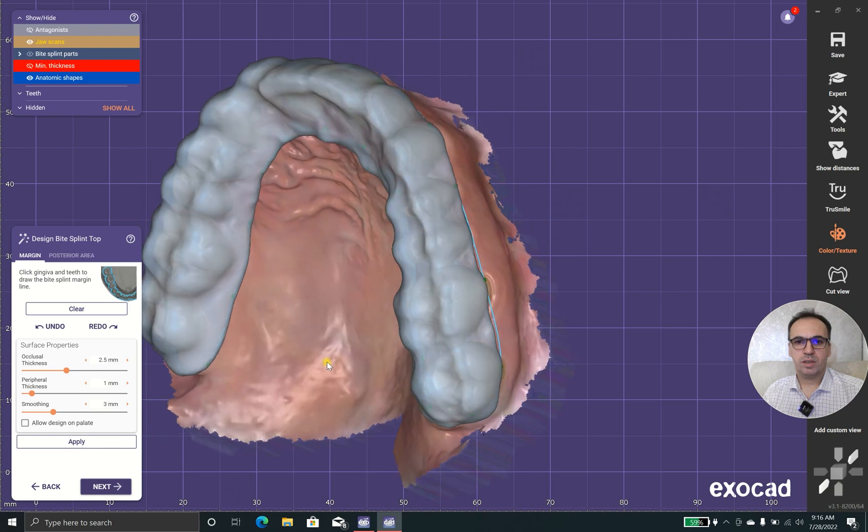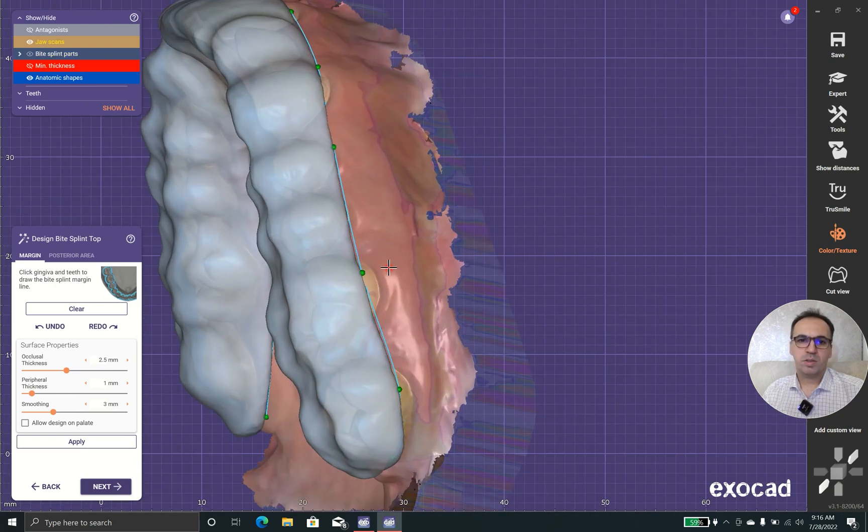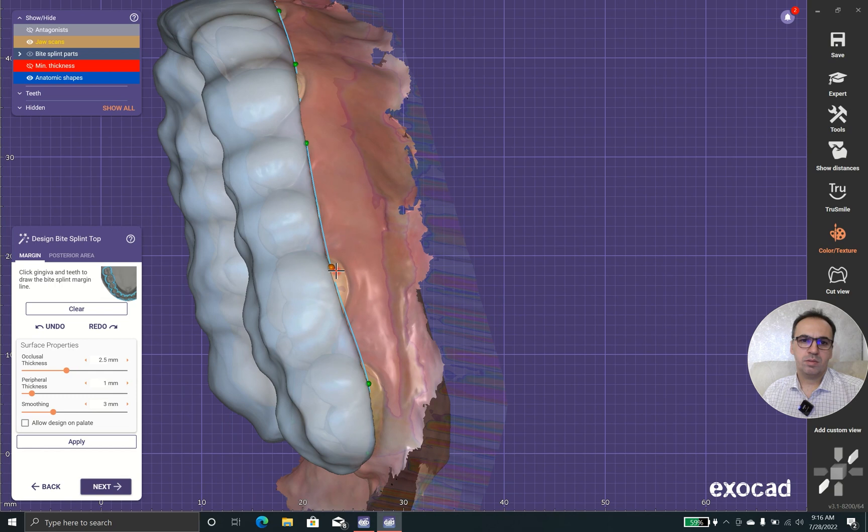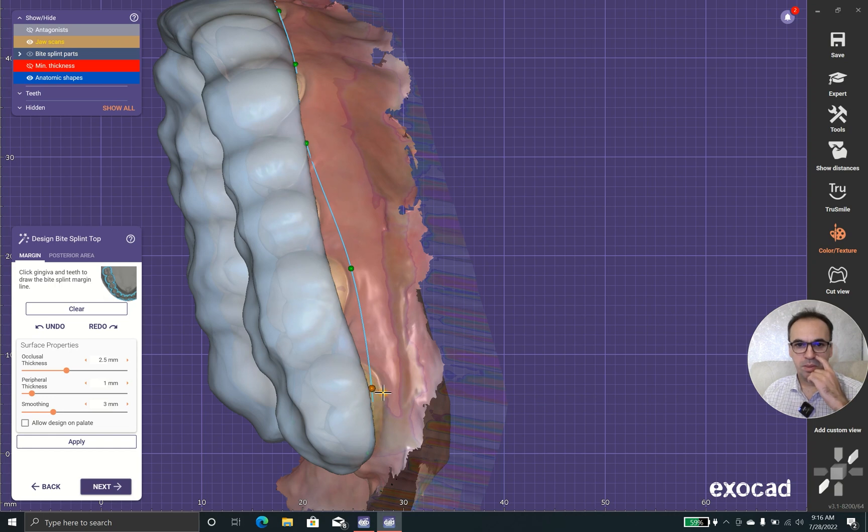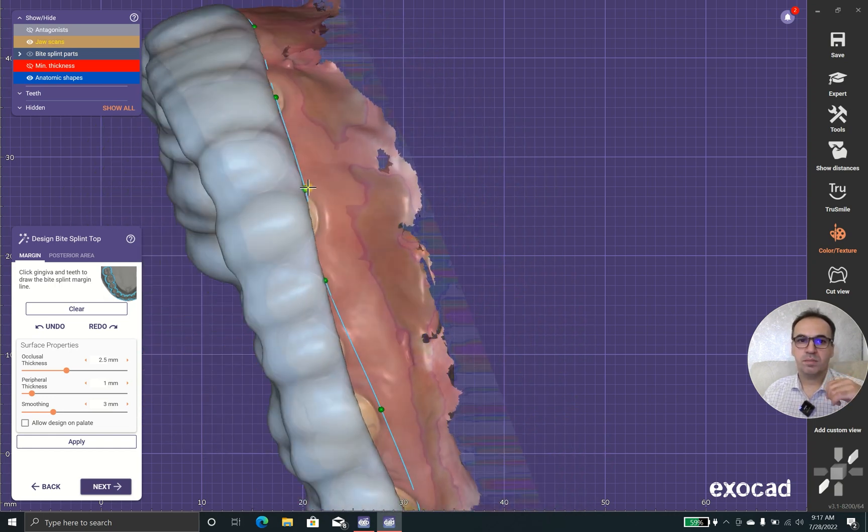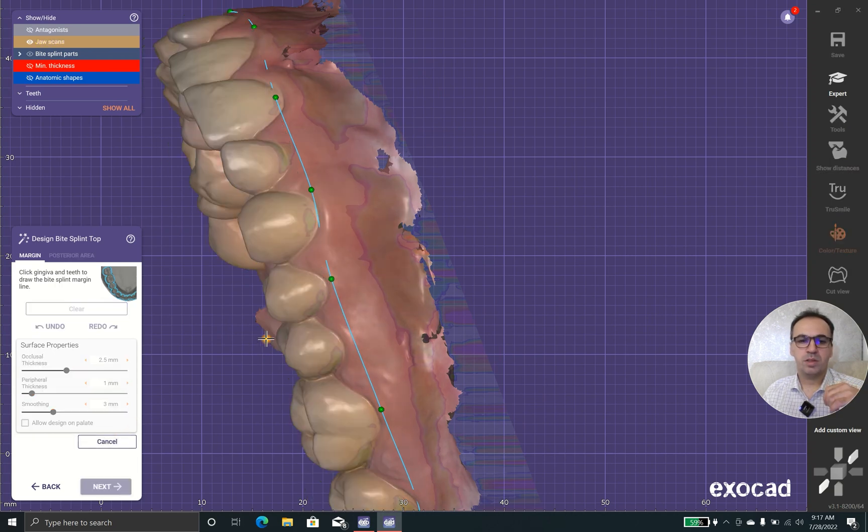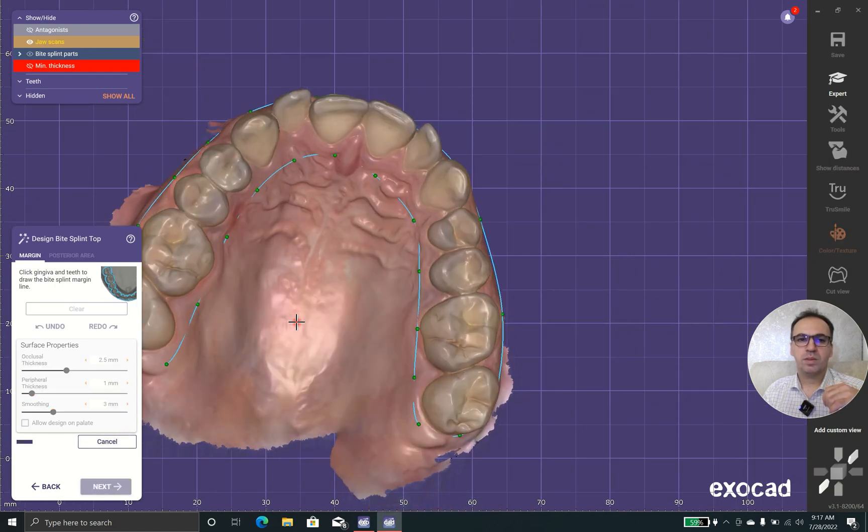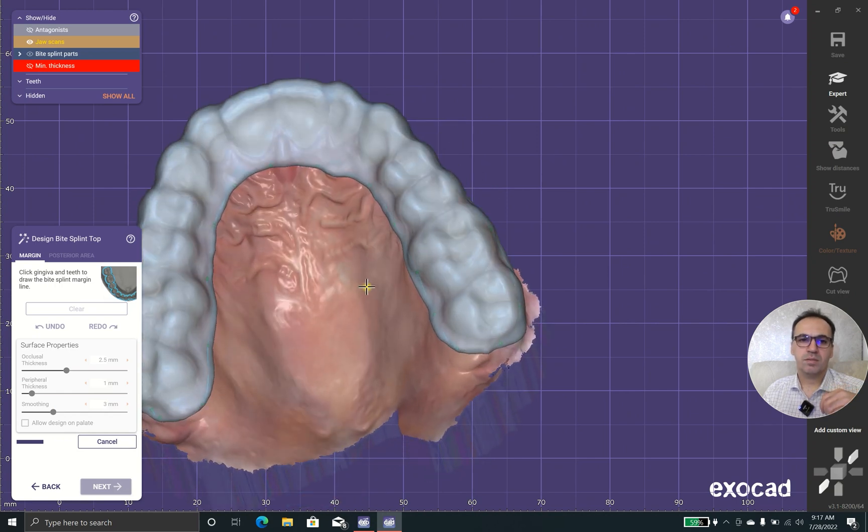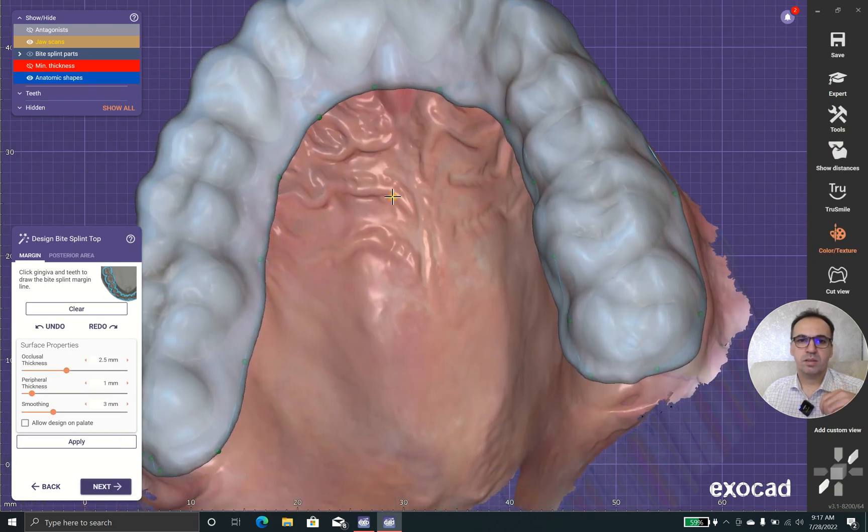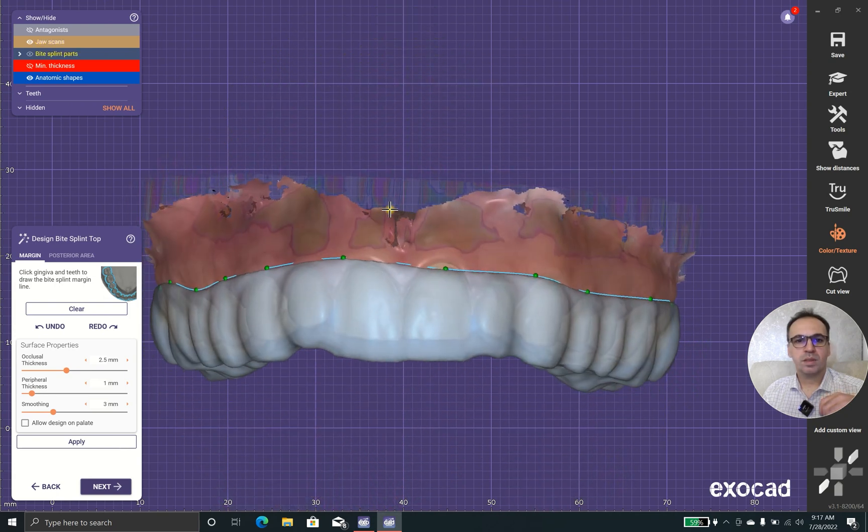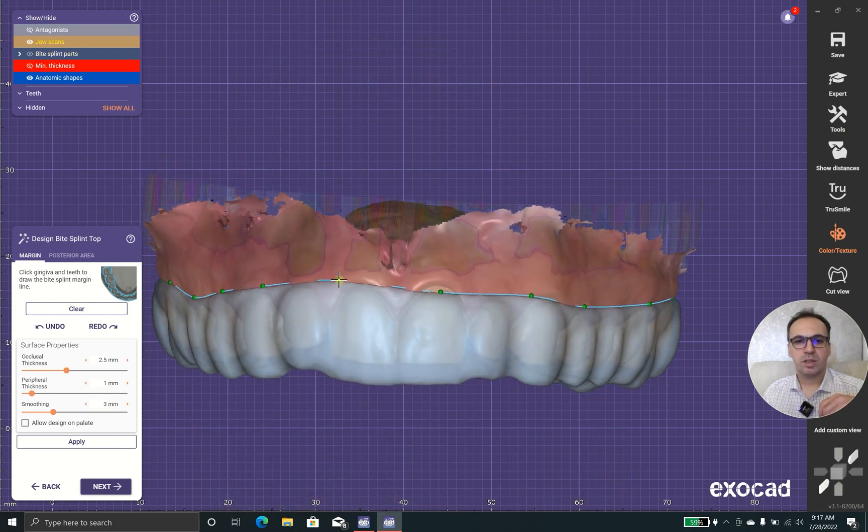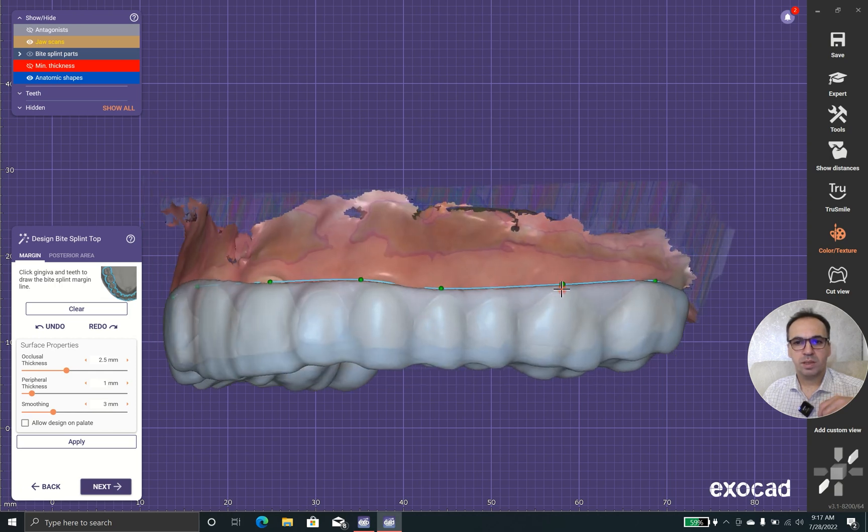Check the integrity. It depends on your design ideas. You can put this over the gingiva like this, but hygiene will be an issue. Or you could go up till the middle of the tooth, but retention will be an issue. You should choose between retention and hygiene. I prefer the root of the teeth to be out of the bite of the splint.